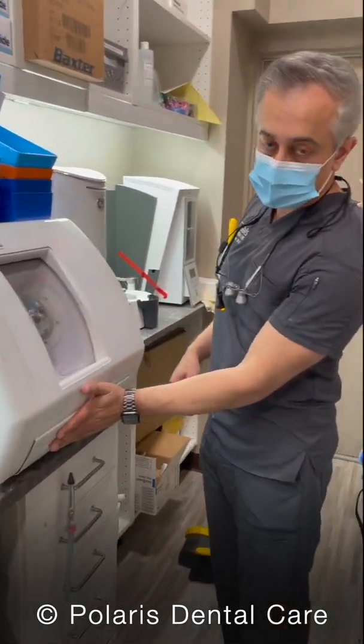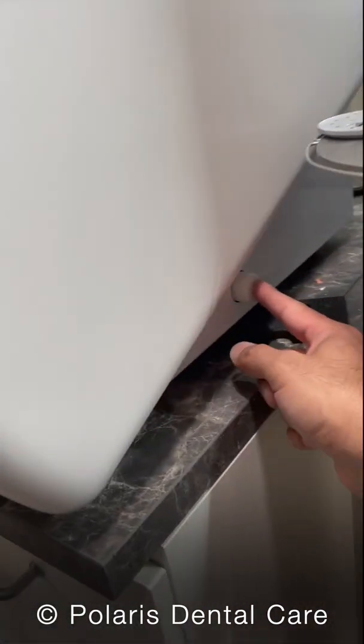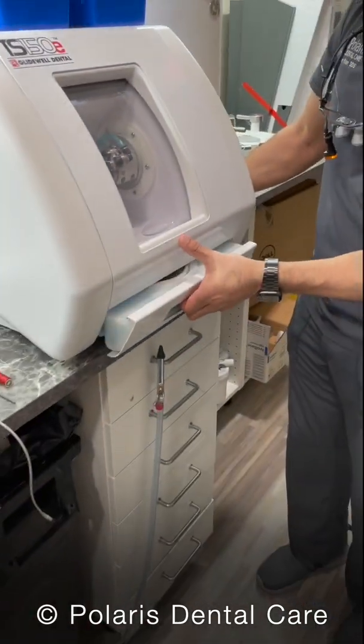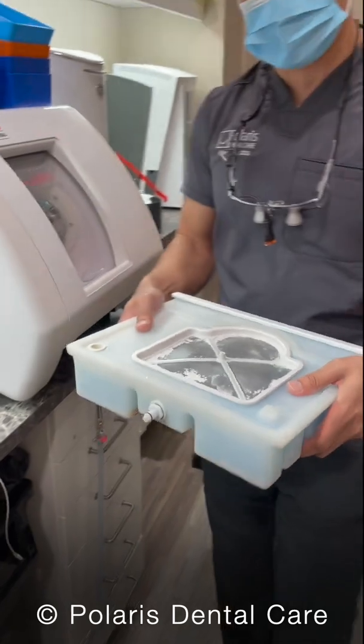The coolant stays in this tray down here. There's a release button right down there. What we're going to do is push that release button and pull this tray out. We're going to take this to the back and I'll show you how to change the coolant. Careful — this thing is full of water.